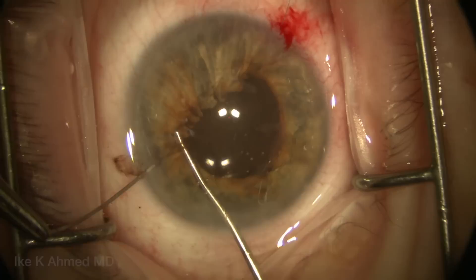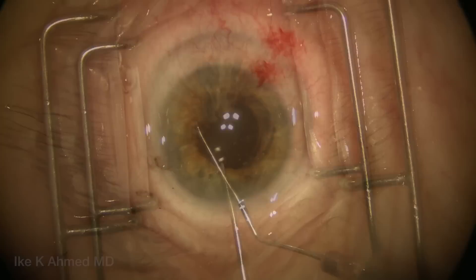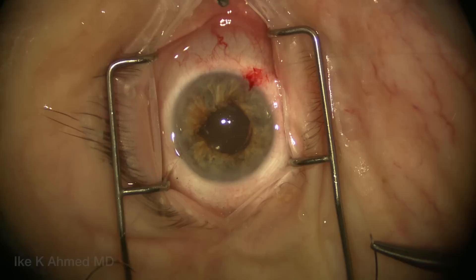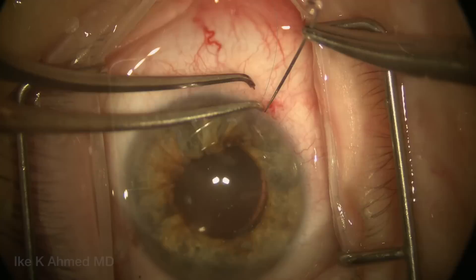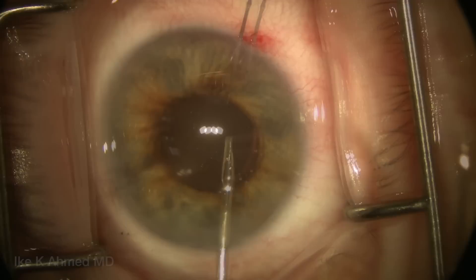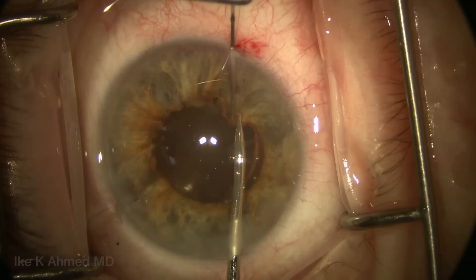We're now ready to make our second pass for the pupillary cerclage. We recognize the initial iris entry point, and the next pass will be made just adjacent to it. This is a double-armed 10-0 Prolene with two CIF-4 curved needles. We go through the same paracentesis we initially came from, grasping the needle close to the swage and placing the first pass very close and adjacent to the initial nasal pass.